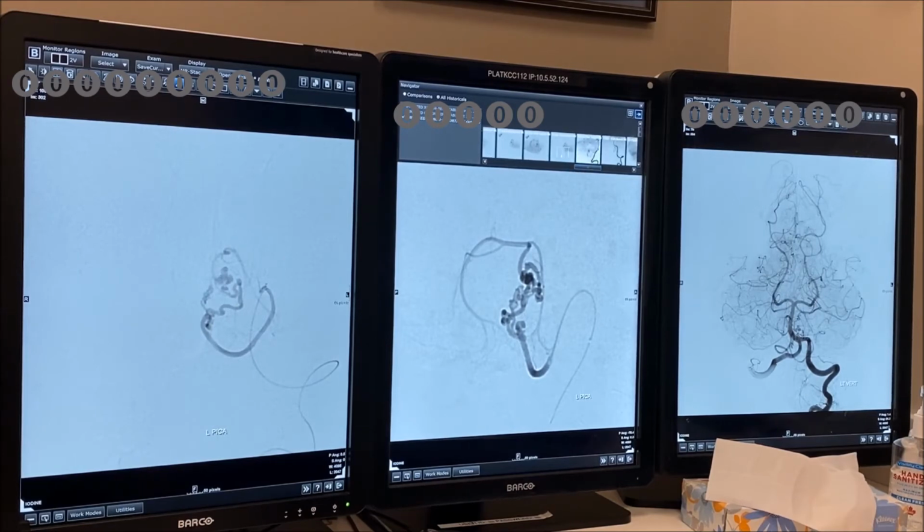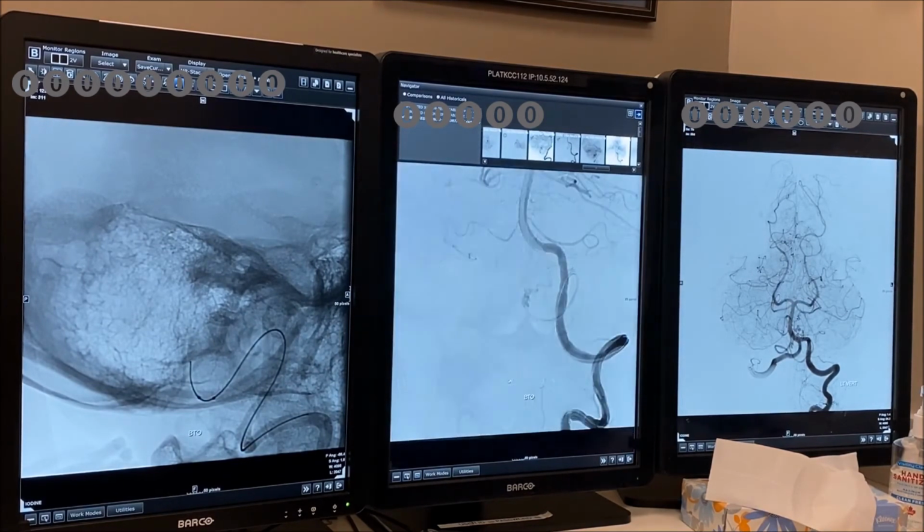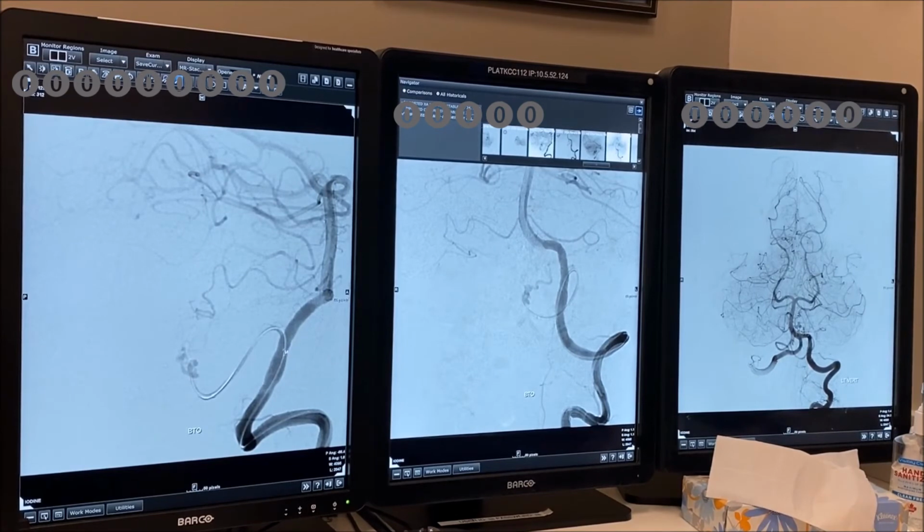You take a balloon catheter. Look, bizarre lesion, eh? So you take a balloon catheter, and here's a septor. Okay. And then you inject here in the injective vertebral. What's going on here? How did this segment fill? It's a collateral from the AICA. No. Or, I knew you'd say that. This hasn't reached here. Oh yeah, the balloon's not occluding. What happened? No, they did a bolus, but this is going around the catheter, you see? Not occluding and filling it. But it is producing some decrease in flow.